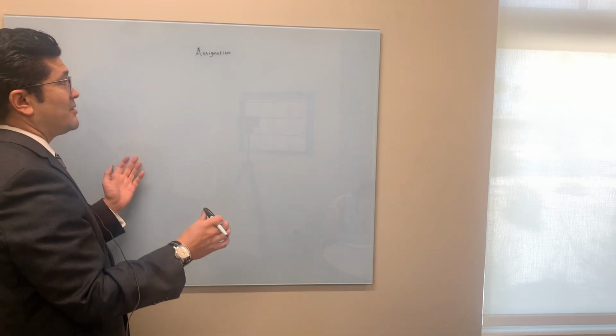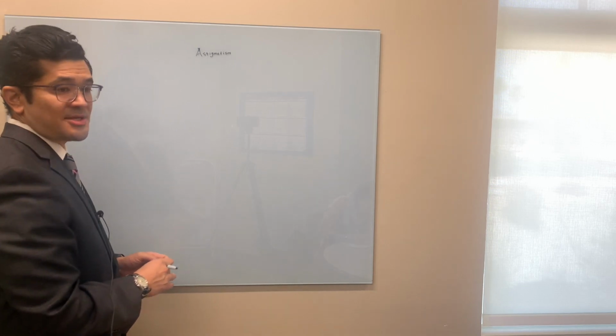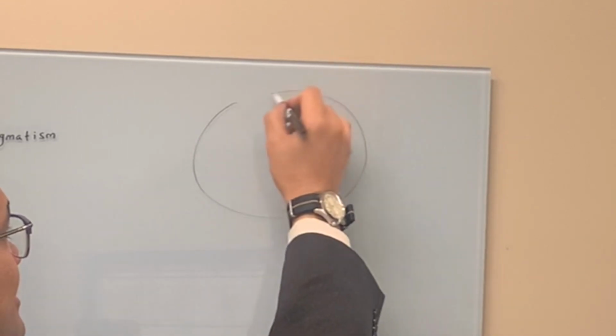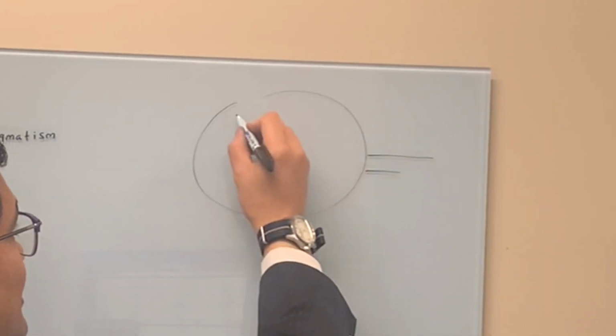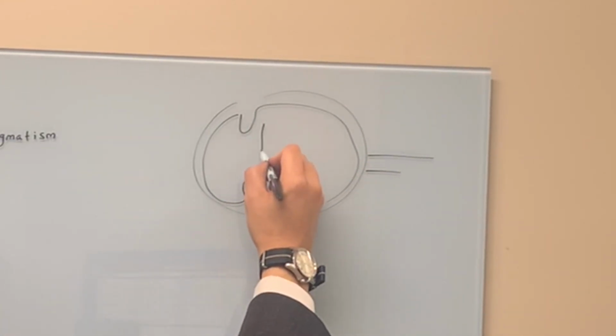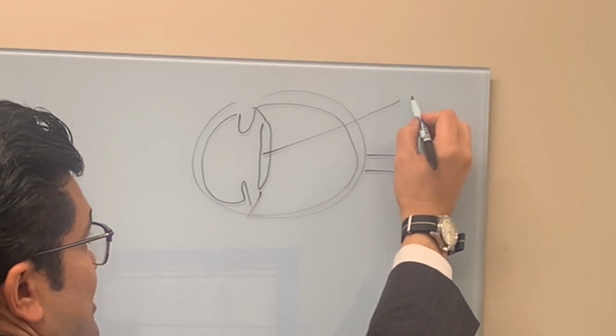In a broad overview, there are 2 general ways to adjust astigmatism during cataract surgery. So let's go back to our drawing. If you remember, when we do cataract surgery, we can put a lens in the same spot where the cataract used to be.